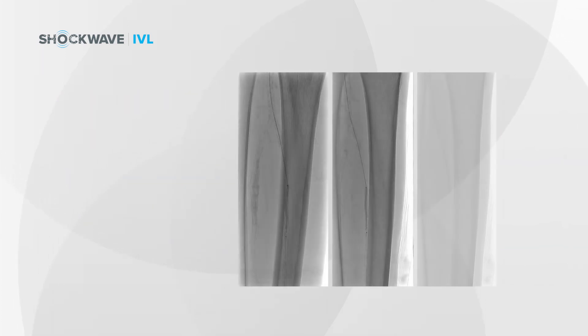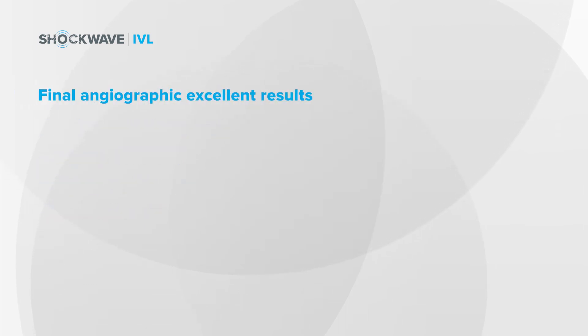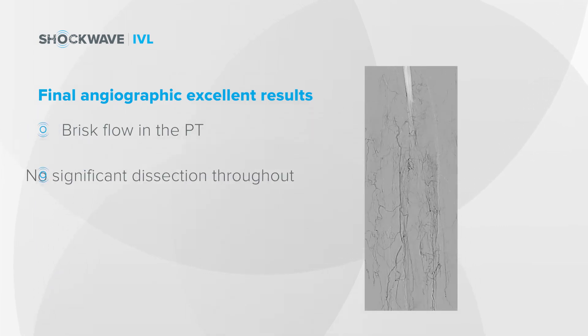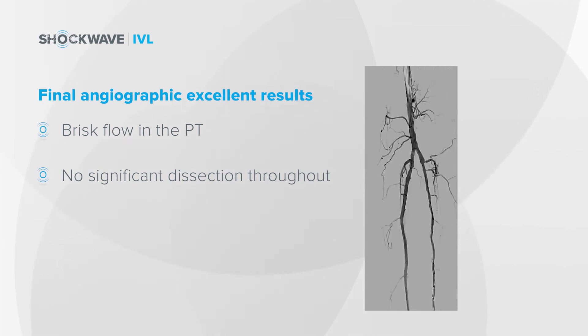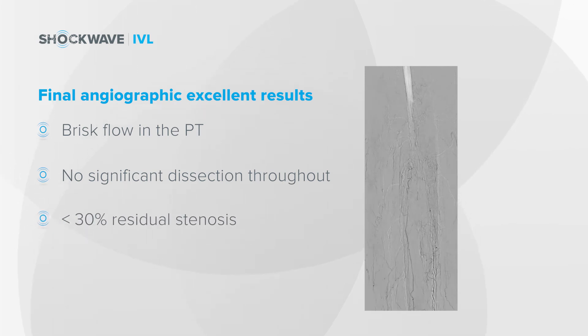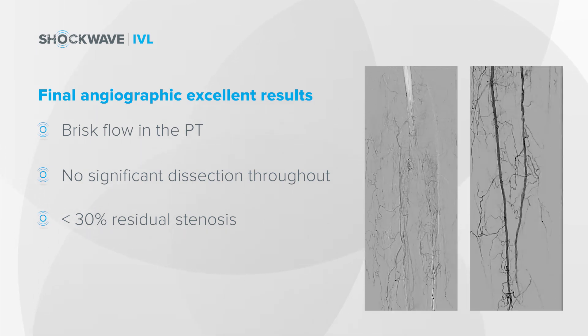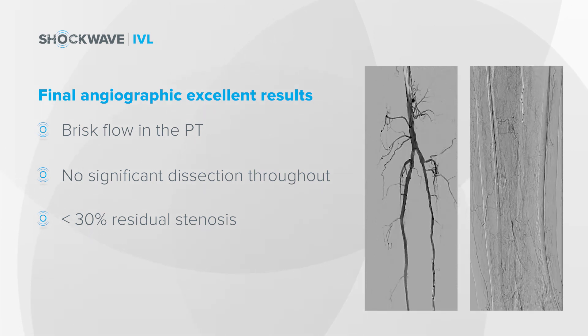This demonstrates the pulses that were delivered across the posterior tibial artery with the intravascular lithotripsy balloon. This shows the final angiographic result in the posterior tibial, and you can see here that there's really excellent result. This had been a subtotally occluded vessel with very minimal distal flow initially, and after the intravascular lithotripsy, there's less than 30 percent residual stenosis across that entire posterior tibial segment. The final runoff down to the level of the foot demonstrates that the flow in the posterior tibial is at least as fast as the flow in the anterior tibial as well.